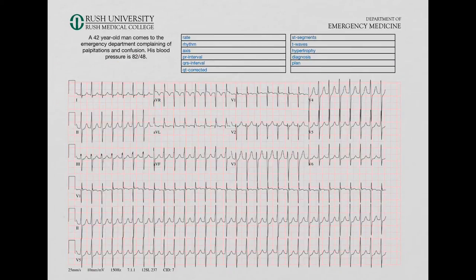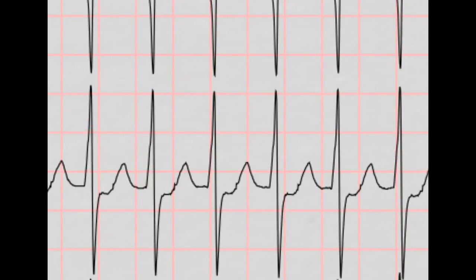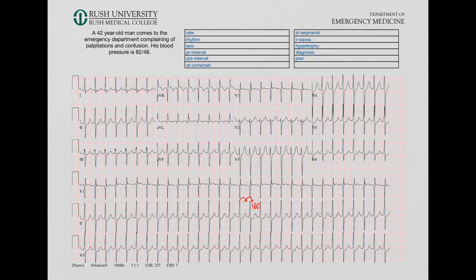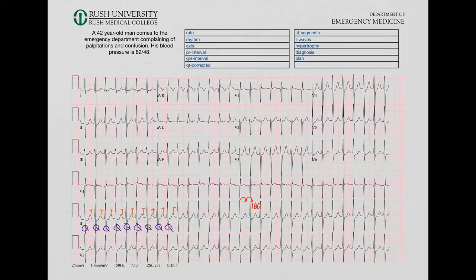Let's move on to the next EKG. This one is obviously going fast. Let's zoom in on a section — we know this is 300, 150, so it's between 300 and 150, closer to 150. Let's call the rate 160. Looking at the rhythm, I don't see P waves anywhere — it's all just QRS complexes and T waves. Wherever this rhythm is coming from, it's not generating an atrial depolarization, so it's probably not coming from the SA node. This fast tachycardia of about 150–160 without P waves is usually going to be an SVT — supraventricular tachycardia. We know that because the QRS is narrow, meaning depolarization is going through the bundle fibers and not generated in the ventricle. So we're going to call this rhythm SVT.